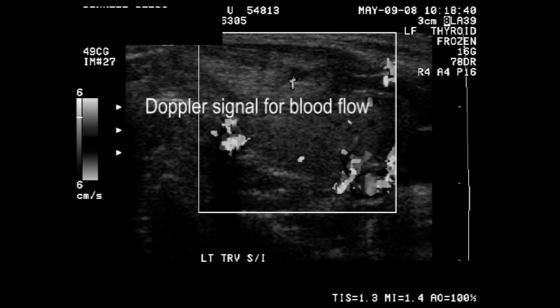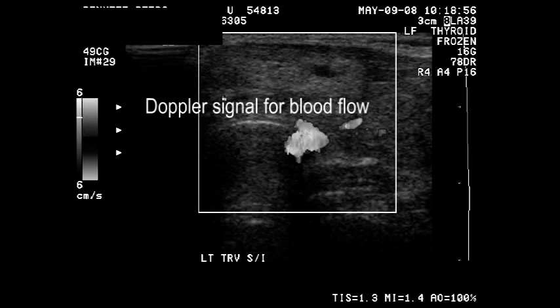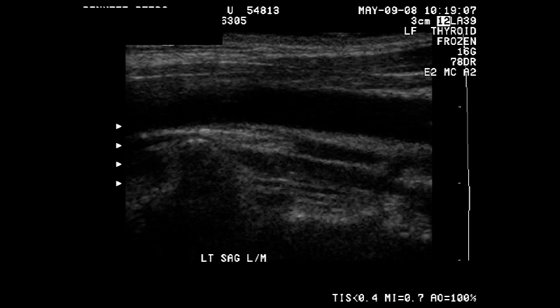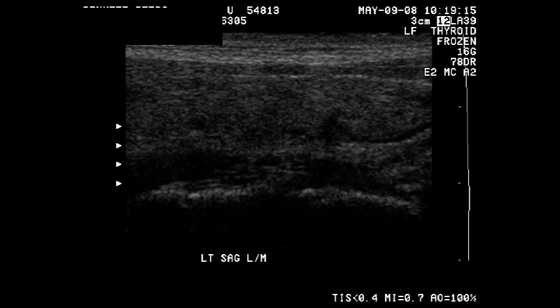Here the ultrasonographer has turned on her Doppler probe to measure blood flow. If these were actually color images, we could identify the vessels. Again, this vessel is the internal jugular. We know this from the anatomy but need compression to verify.